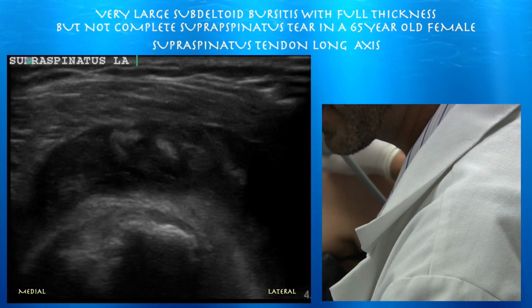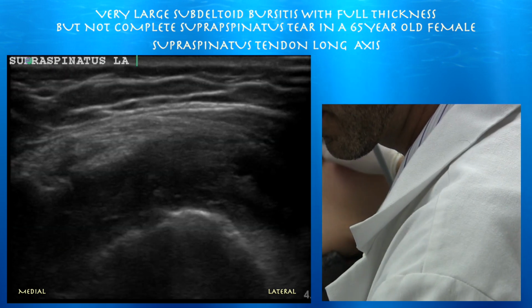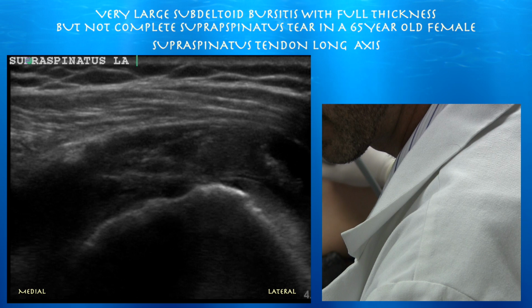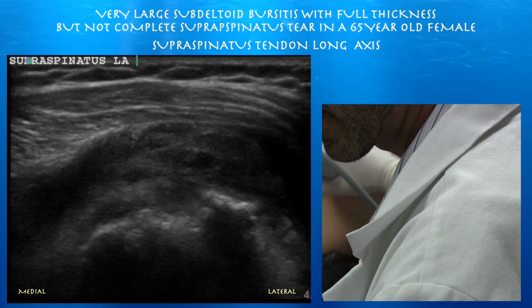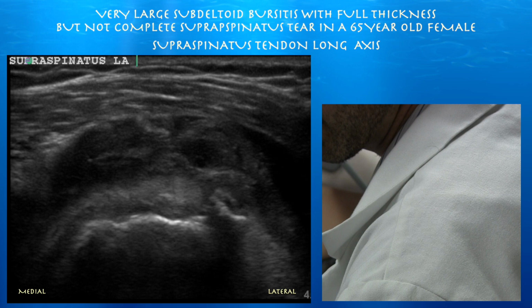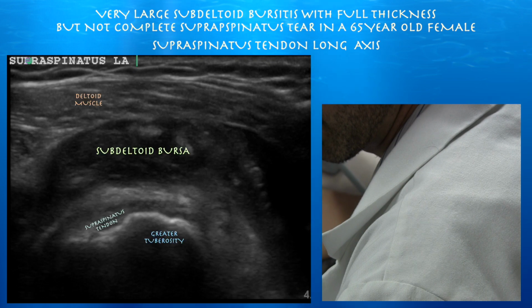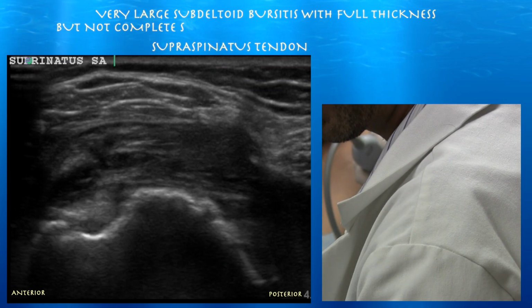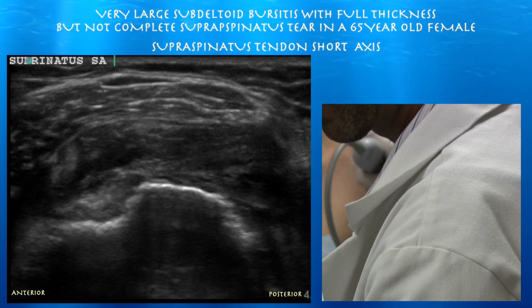And one more on the supraspinatus, looking at it in long axis or modified Crass. Here you don't see any tendon at all over the articular surface of the humeral head, consistent with a full thickness retracted tear of the supraspinatus tendon. However, as you scroll through the tendon, there are some fibers remaining, consistent with a full thickness but not complete supraspinatus tear.